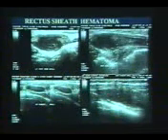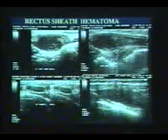Like this, a small child of only 3 years of age fell down and struck his belly anteriorly, and this is a big rectus sheath hematoma which is seen over here. You can see it's a rectus sheath hematoma in the anterior abdominal wall, and you can see a chest wall hematoma. Again, due to direct injury, there is a chest wall hematoma which is a confined, well-defined, loculated hypoechoic mass seen here in the chest wall, and this is the anterior abdominal wall hematoma, a rectus sheath hematoma sustained in a young child.